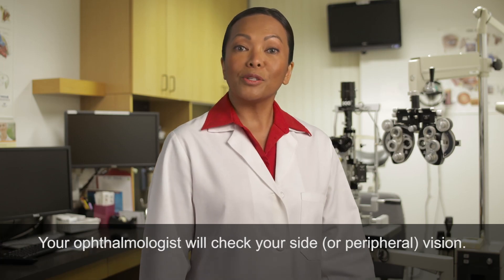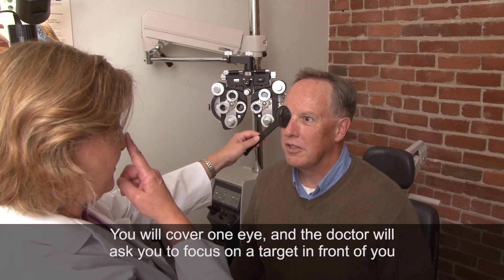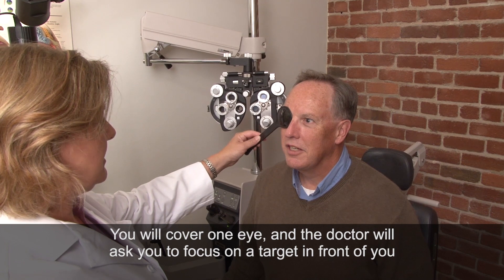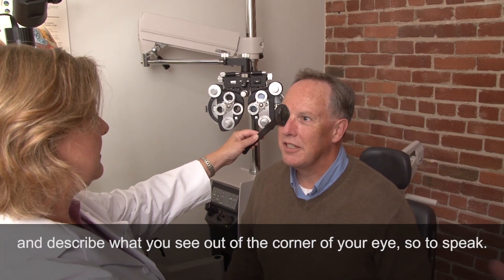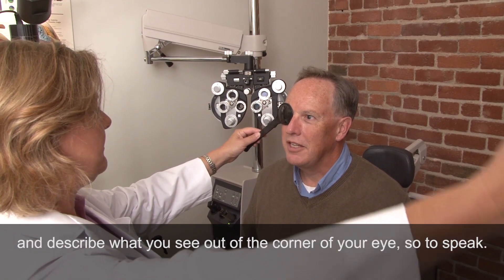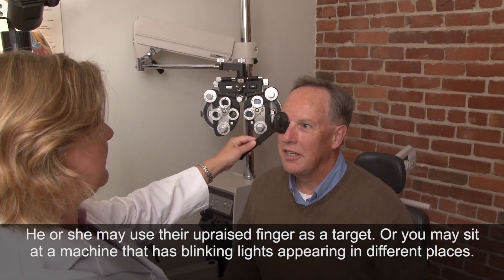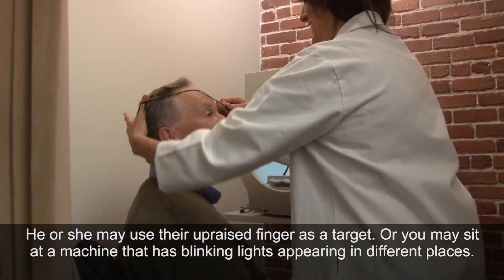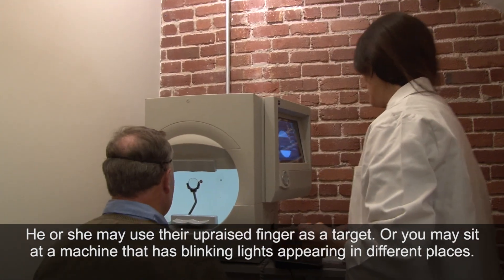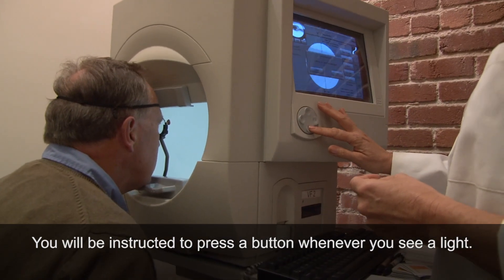Your ophthalmologist will check your side or peripheral vision. You will cover one eye and the doctor will ask you to focus on a target in front of you and describe what you see out of the corner of your eye. He or she may use their upraised finger as a target, or you may sit at a machine that has blinking lights appearing in different places. You will be instructed to press a button whenever you see a light.